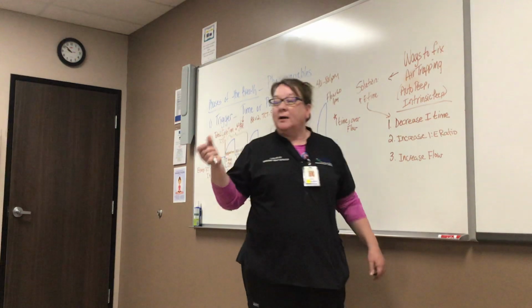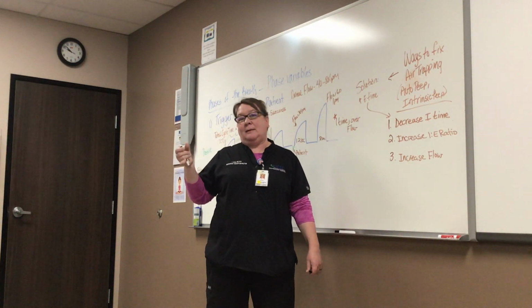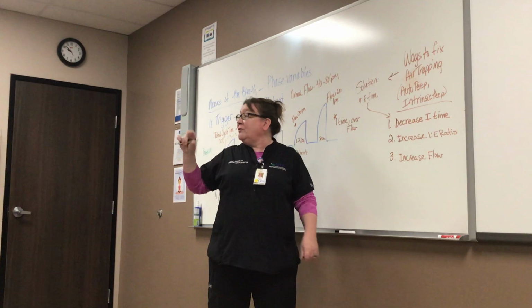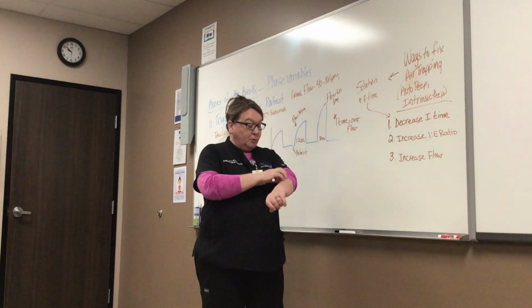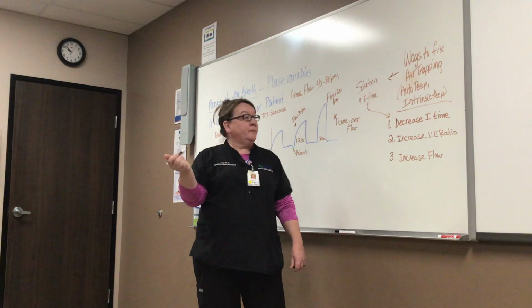And like I said, it won't let you set it. The ventilator will give you a little warning because you're trying to do something that you can't do. So it doesn't actually alarm, and you'll be like, Ms. Fawcett, the volume won't go over 400. I'm trying to do more, and it's because your flow's too low. Once you fix your flow, then you'll be able to fix your volume that you want.